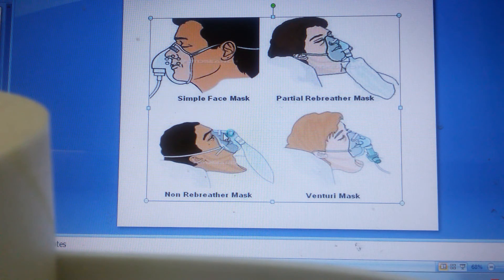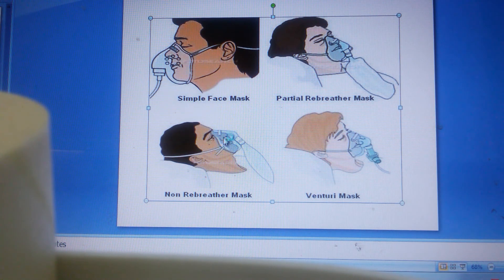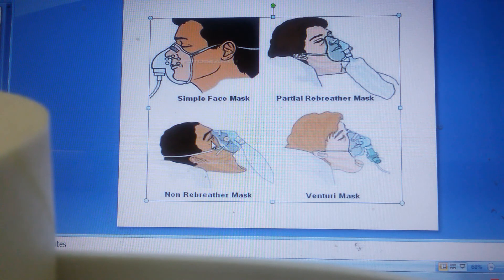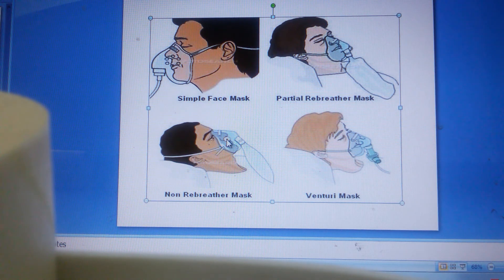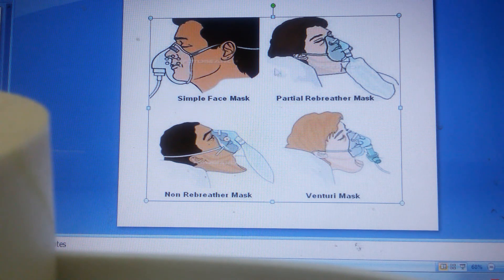This is the non-rebreather mask. There is a flap which closes the exhaling vent — the opening present in a normal face mask is closed here with one flap. There is also a valve which prevents exhaled air from entering into the bag. That is why 100% oxygen will be inhaled when the client breathes in. The flap opens while the client exhales, so the exhaled air goes out from the mask, and 100% oxygen is provided to the patient when they breathe again. This is the Venturi mask.